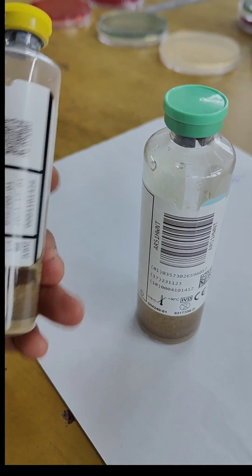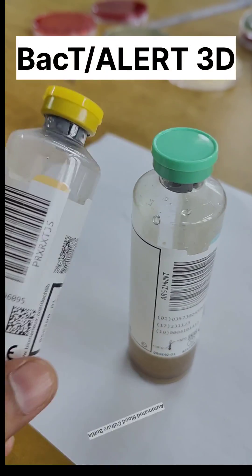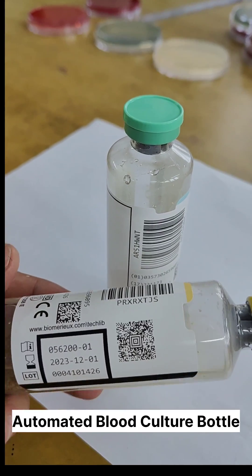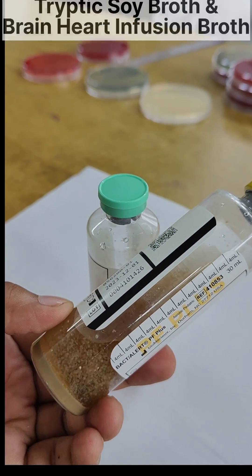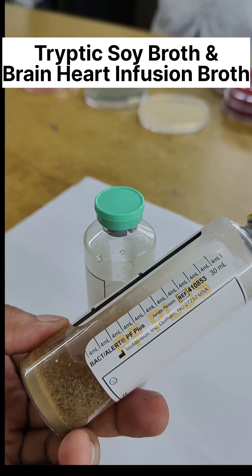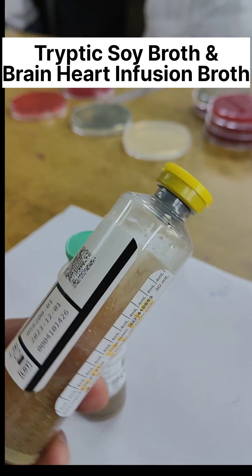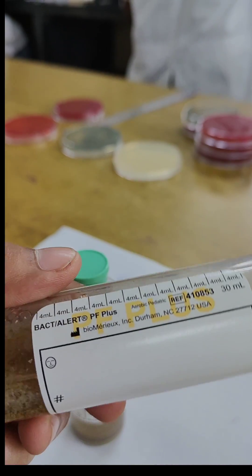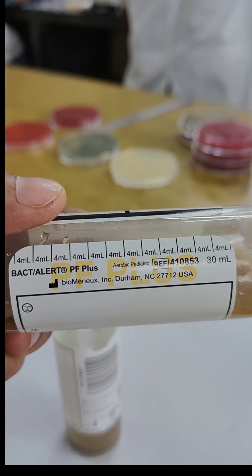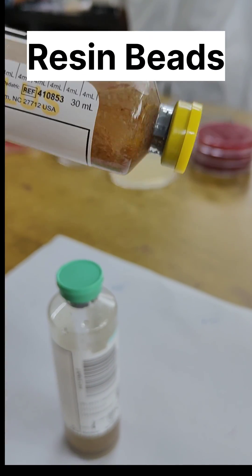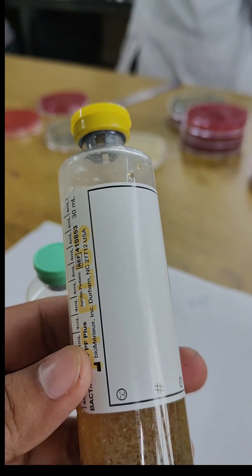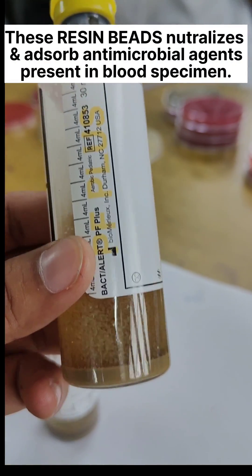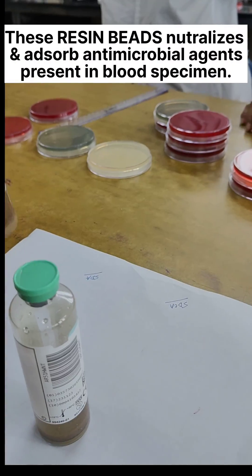These are BactiAlert automated blood culture bottles and the liquid medium inside this bottle is usually tryptic soy broth and brain heart infusion broth. In this liquid medium you can easily see that plenty of small absorbent polymeric beads are present which function to neutralize the antimicrobial agents present in blood specimens.